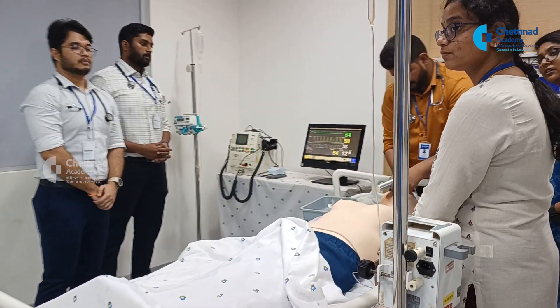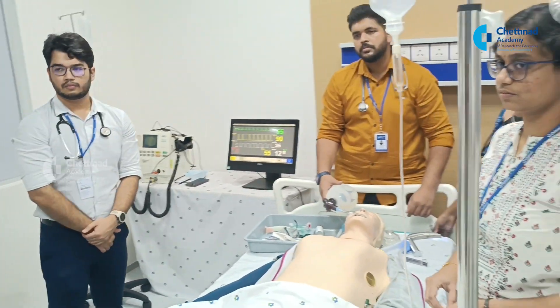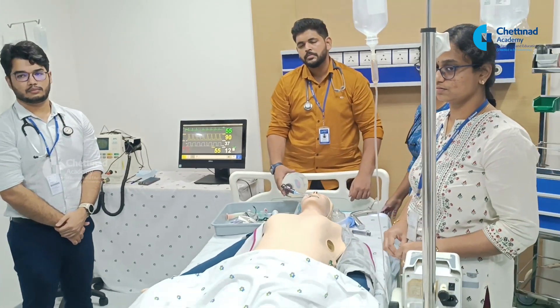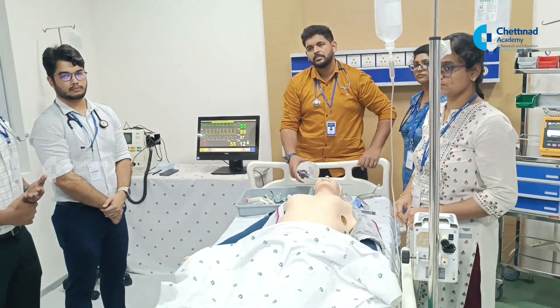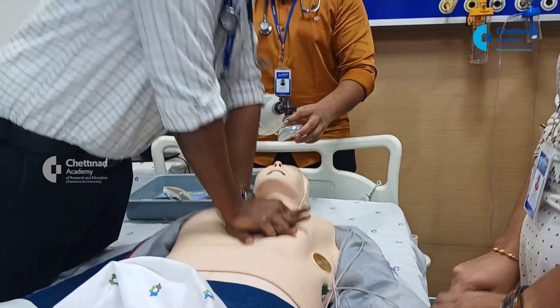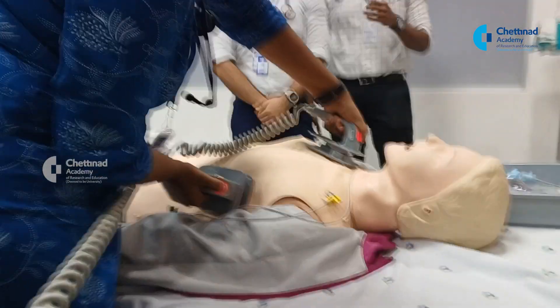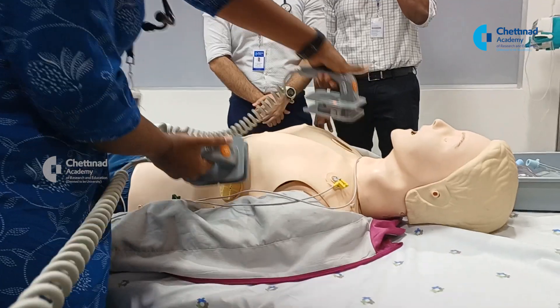A patient has experienced cardiac arrest in the ICU — intensive care unit — and medical professionals are required to perform CPR and utilize other methods to save the patient's life.